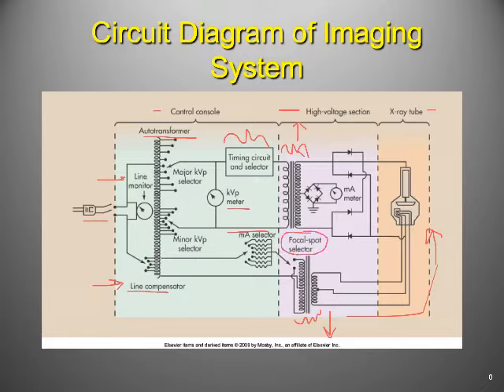but this focal spot selector, we've not yet got quite enough information to talk about it fully. We will be coming back to it, so just put a little star next to it. The focal spot selector allows us to choose different focal spot sizes, whether it's small or large. So just file that away, we'll be coming back to it. It's not something I'm going to test you on right now.